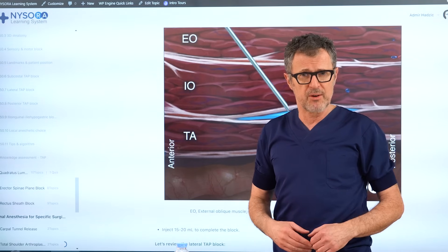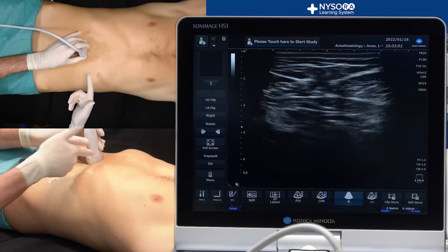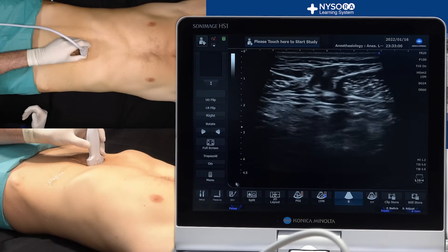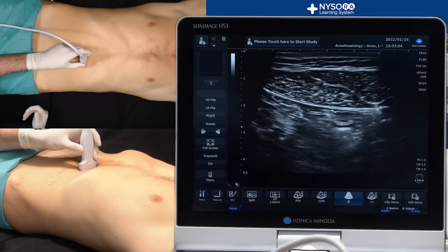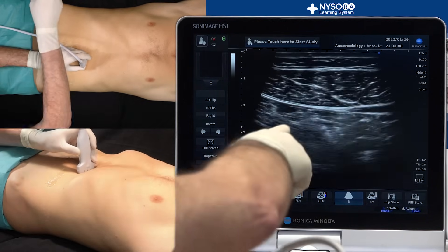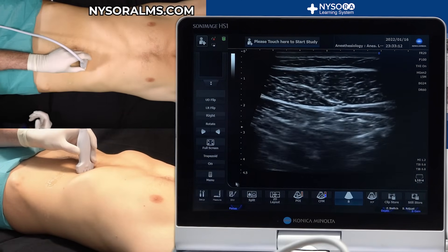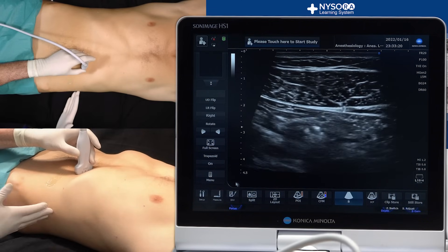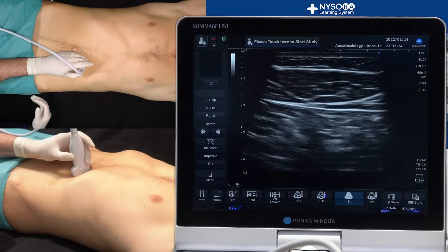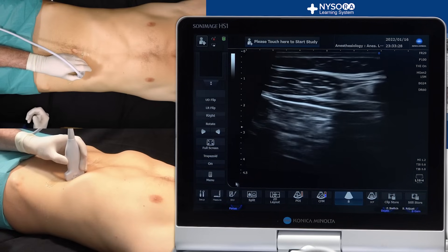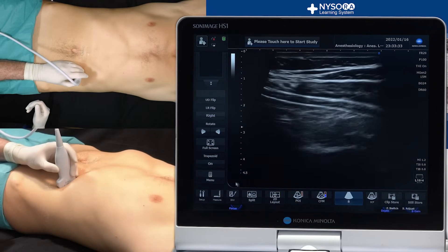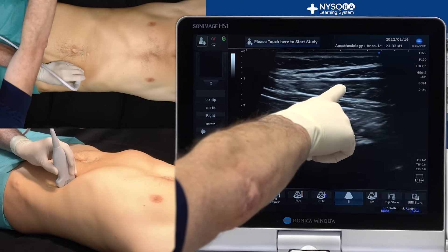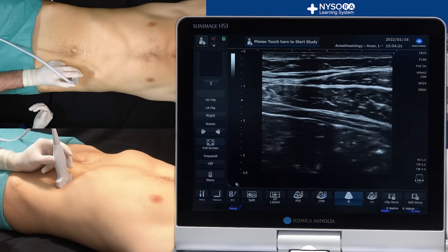We're going to demonstrate that in a video. Start scanning from the midline — here we see the junction between the two rectus abdominus muscles and the aponeurosis in the middle. Scan laterally until you see the rectus abdominus muscle. Here you can see the fascia of the rectus abdominus as well as the peritoneum. Scan laterally between the ribs and the iliac bone. As we go lateral, we now see the aponeurosis of the internal oblique muscle and transversus abdominus muscle. Continuing down laterally, here we can see all three layers of the abdominal wall — external, internal, and transversus abdominus.